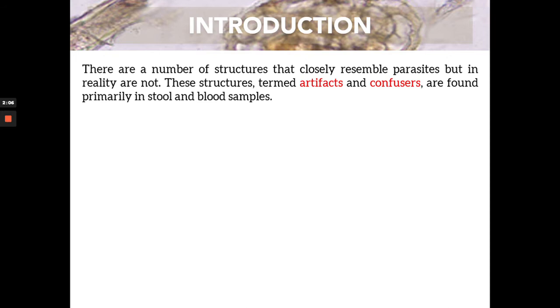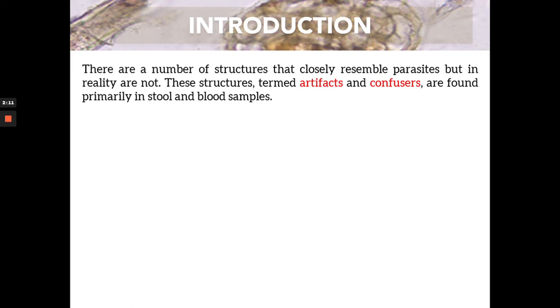What are artifacts and confusers? These are structures that can be found in your specimen — mostly in your stool and blood samples — that may mimic or look like parasites, but in reality they are not parasites. The name itself, confusers, because it can make you confused and make your examination difficult.